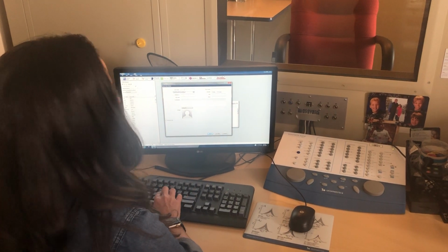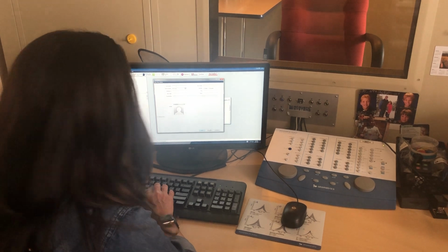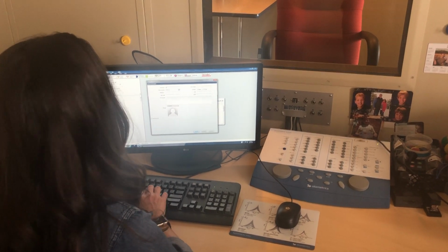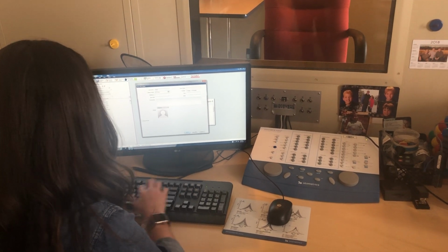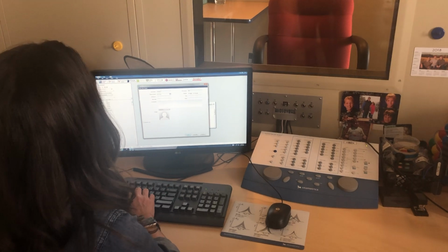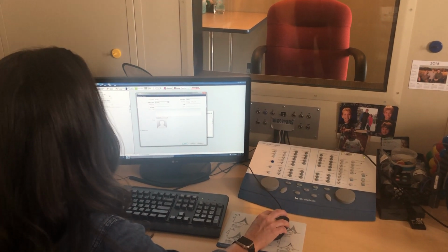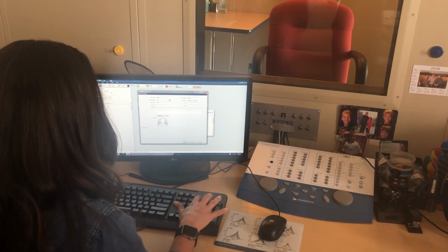So whoever's going to be tested first, give me a name and I'll go ahead and put you in. Who's going to be first? Melissa? What's your last name, Melissa? Davalos. Spell it for me. D-A-V-A-L-O-S. Okay. Can't type today. E-L-I-S-S-A. Did I spell it right? Yes, ma'am. And birthday? 2/4/99.